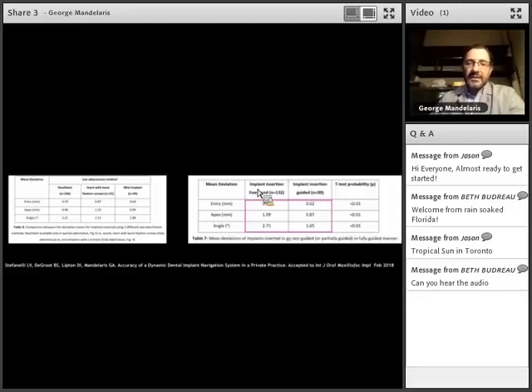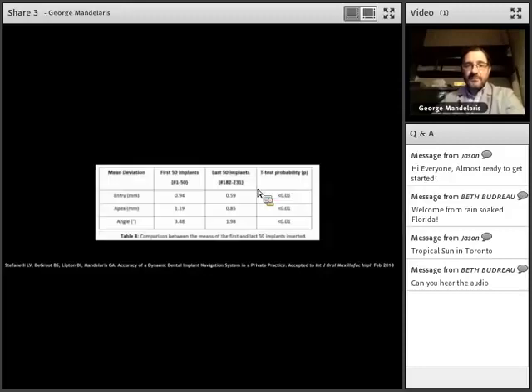But depending on the circumstances, if you place the implant freehand but had created the osteotomy site using navigation, you had very favorable numbers. I would say even better than traditional CT scanning, stereolithography, computer-guided outcomes, and certainly much better than freehand surgery.